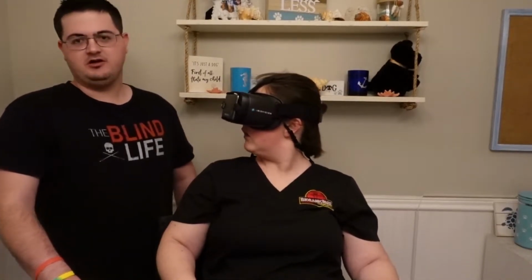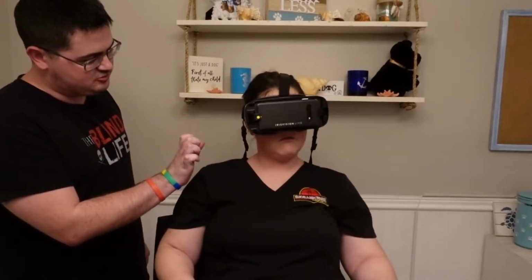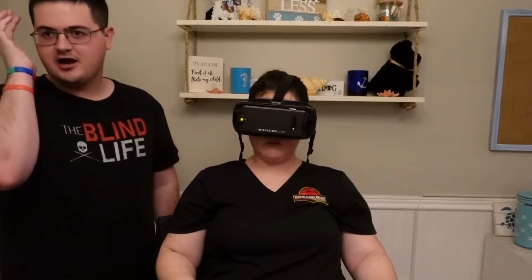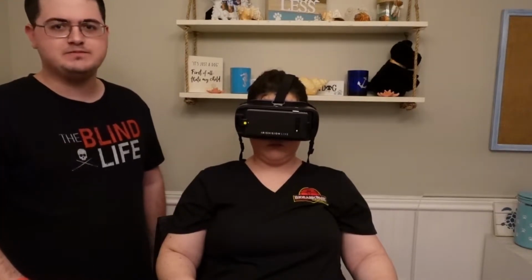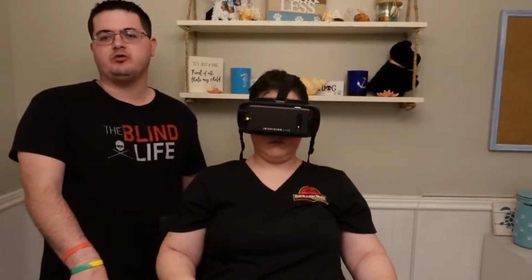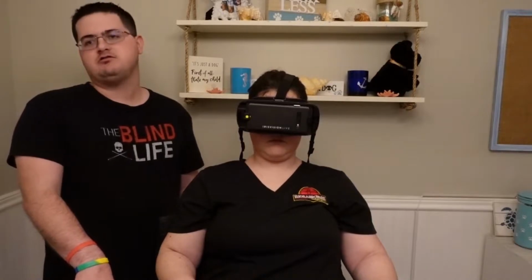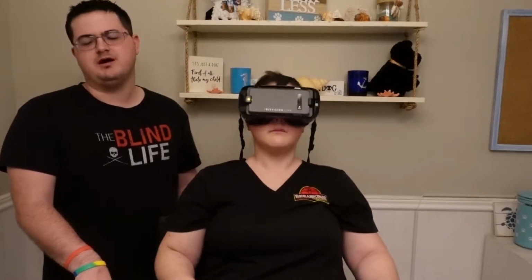If you just click on the side below where the buttons are, there's a pad, and you can feel like an indentation. There's a physical tell for you to know it's the pad. You just tap it twice, slow little taps, and then it'll make that noise. Once it's making that noise, it wants you to talk. So you just say the mode you want, and it'll bring you to the mode. Even if you're in something like Iris Reader, if you just tap it and say scene with bubble, it takes you to scene with bubble.